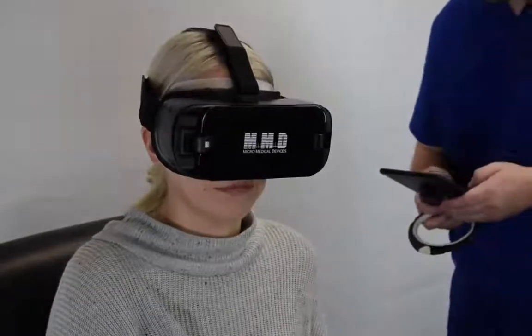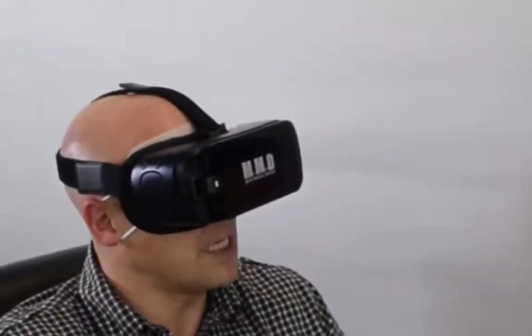One of the benefits offered by the VF2000 is that it's easy to use for everyone involved. Let your patient know what tests you'll be running, how long they'll take, and what to expect.